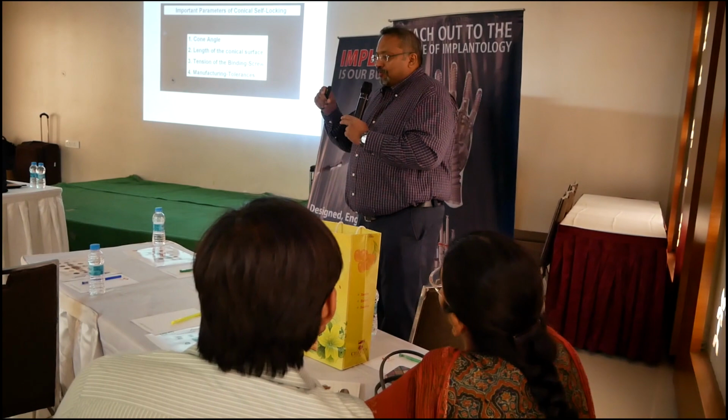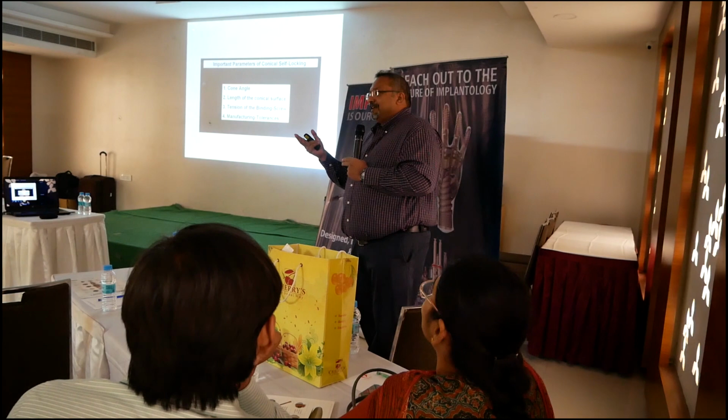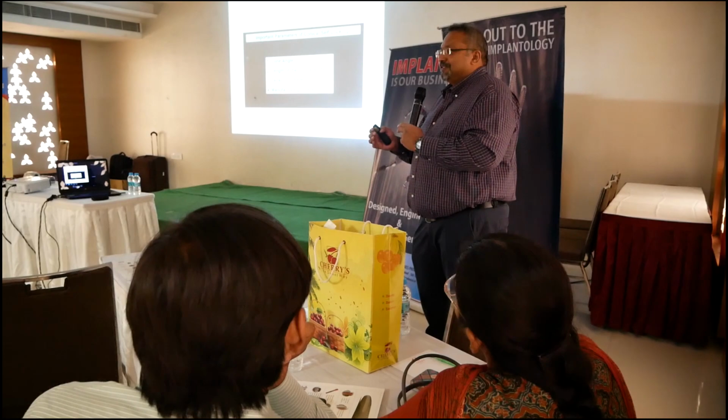Now, if one of you girls tap it, it might go only halfway through. And if I tap it, it might go all the way. So it depends on how much strength you have, right? There is no control over how much force you're going to use. So to take away all that guesswork, we have a screw which takes the abutment to its final position, right?